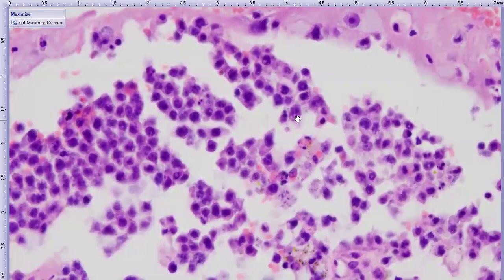The first stains, there was just a lot of background staining, and so it was really hard to decide whether what we were seeing was true immunolabeling or not. The histo lab did some finagling and tweaking of the protocol. And then they repeated the CD3 and CD20, and they also did a CD79A.